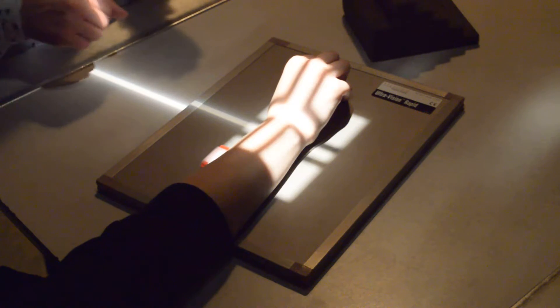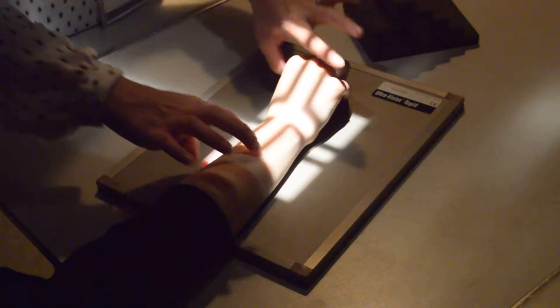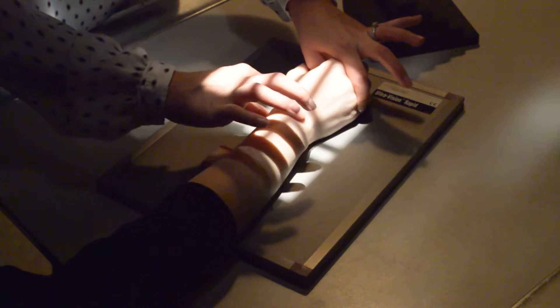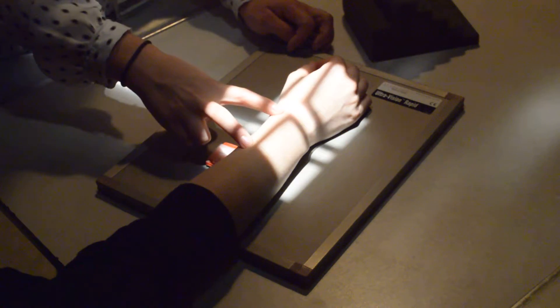Going on to an oblique. So we do external oblique. Still centered at that wrist joint. Marker. You need to include the distal one-third. You'll visualize the metacarpals.